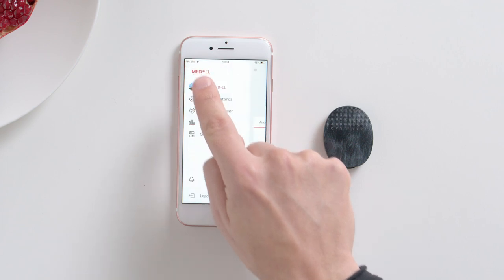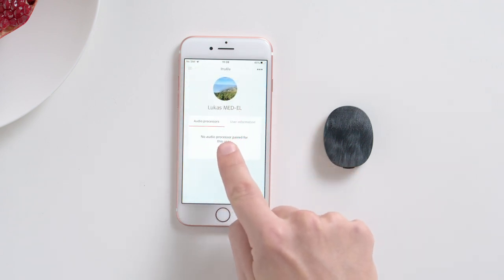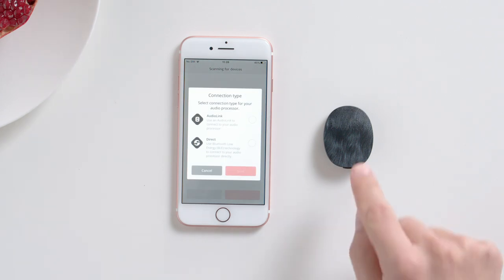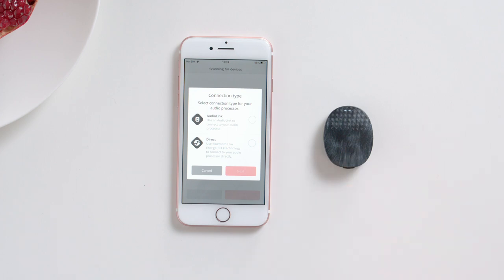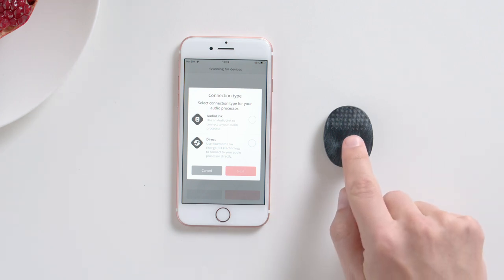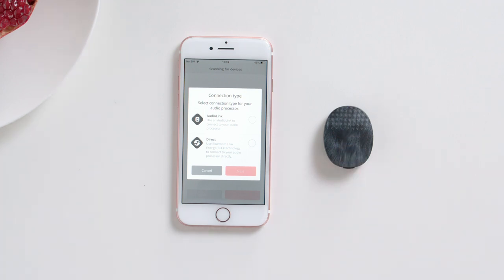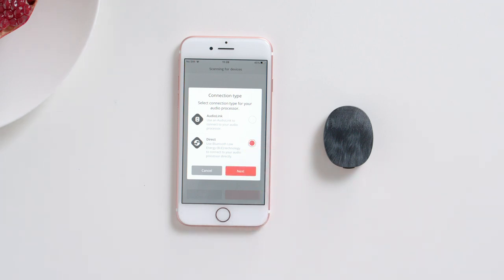If the pairing screen does not appear automatically, navigate to your profile and under Audio Processor, tap Pair Now. Then turn RONDO 3 off and then on again. Select the Direct Connection option and tap Next.